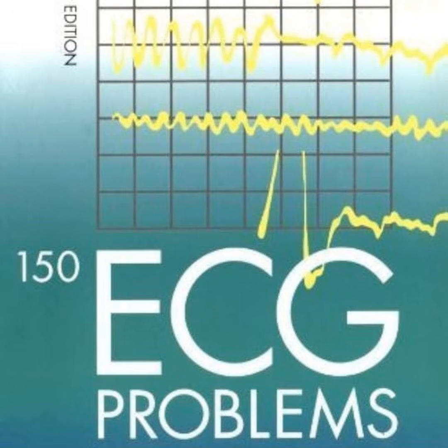Okay, let's unpack patient A first. A narrow complex at exactly 300 beats per minute. That is the absolute hallmark of atrial flutter with one-to-one conduction. Because the flutter circuit in the right atrium circles at exactly 300 beats per minute. Precisely. Now, usually the AV node acts like a physiological gatekeeper. It blocks out every second or third impulse so the ventricles don't race too fast. But in one-to-one conduction, that gate is just wide open. Every single flutter wave triggers a ventricular depolarization.